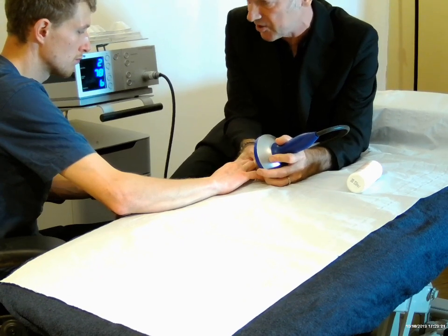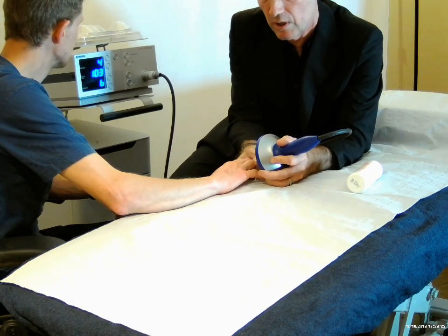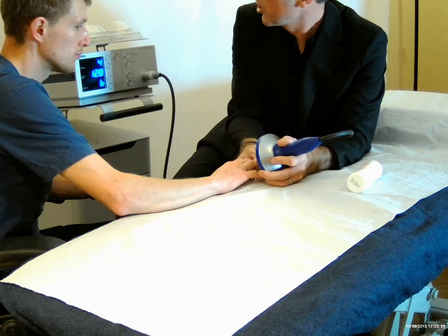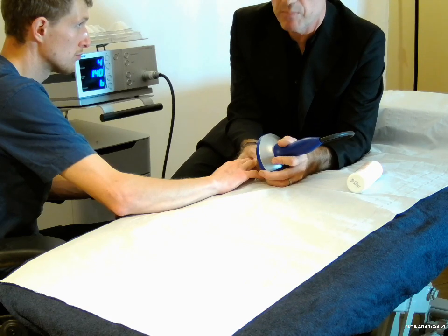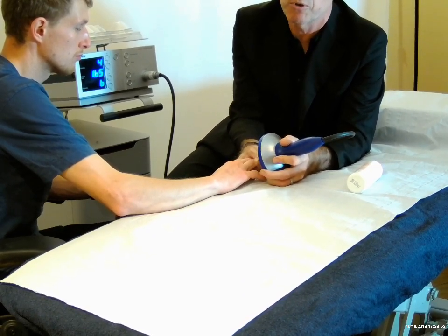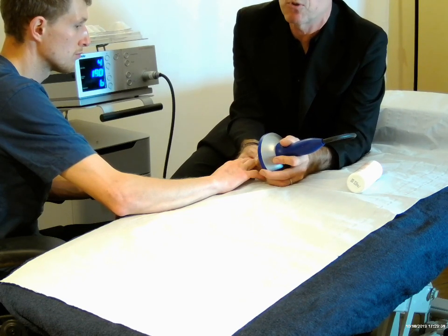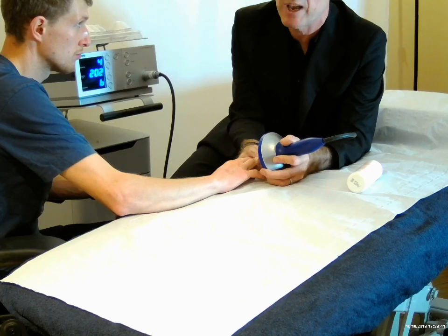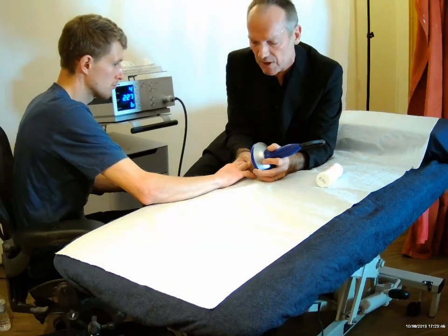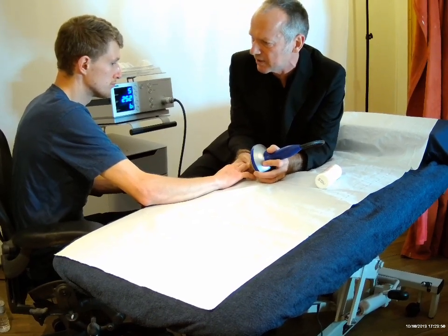Now can you feel much there? Not much, and we're not expecting to, so we're going up to 4. In all probability, the practitioners watching this will not go beyond 3 to 4 out of 10, but you'll see here, it's almost like the nervous system entrains to tolerate what you put it through. This patient was actually tolerating 7 out of 10 on that intensity scale, and that's rare for fingers. But if everything seems okay, it's absolutely fine as long as you're monitoring the situation. So up to 5, I expect you're feeling something now.